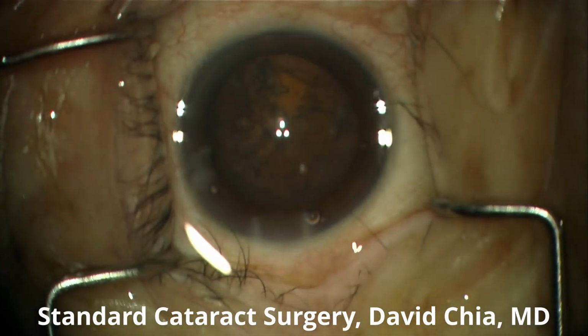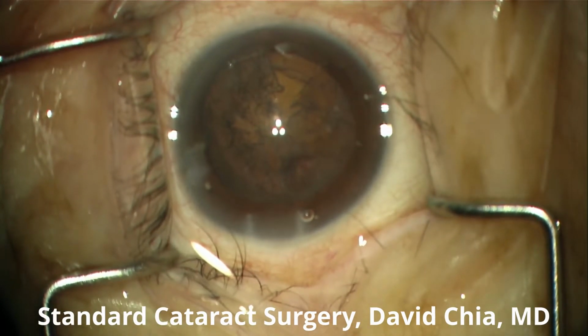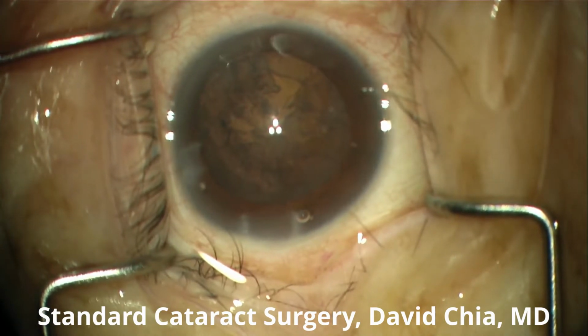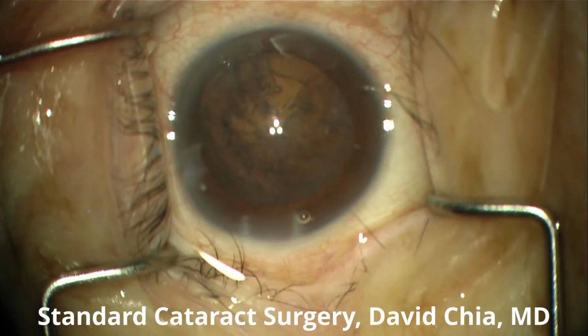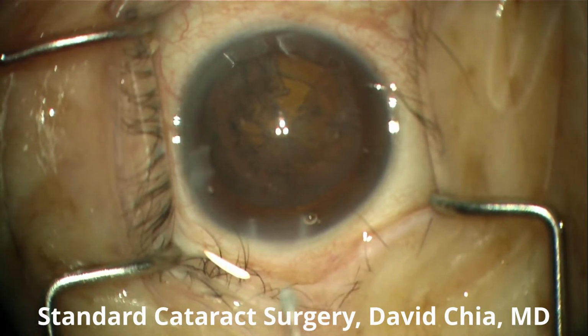So we've withdrawn the phacoemulsification handpiece, and now we're preparing for irrigation and aspiration of that remaining bag. So this is really the cleanup step to prepare for the placement of the new lens.